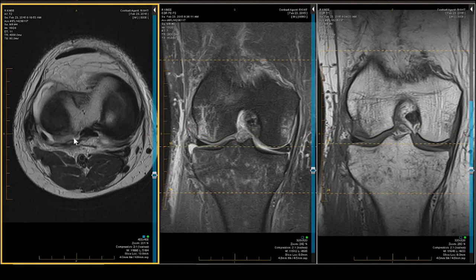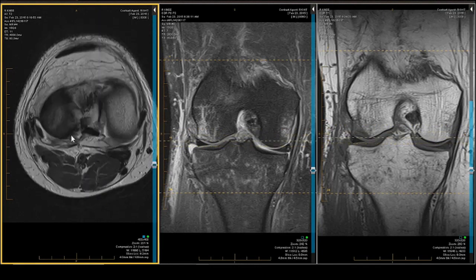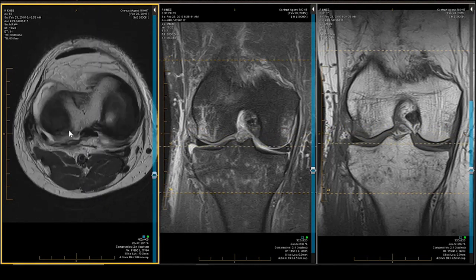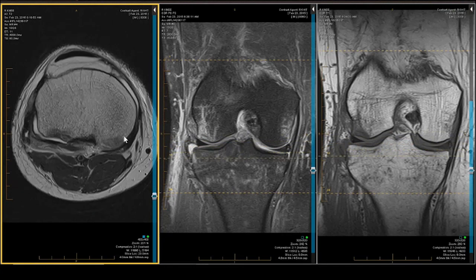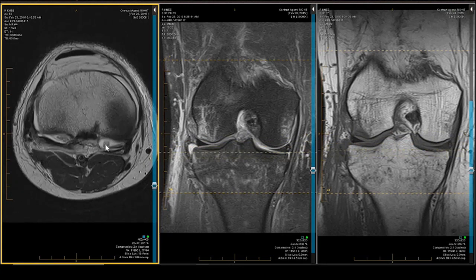On the lateral side at the joint line, things don't look quite right along the posterior bony margin. They look irregular, and if you're experienced you would assume there's a fracture present — you'll be able to corroborate that on the coronals. On the medial and lateral sides there are structures sitting posteriorly; those are bone fragments, not just coagulated blood.